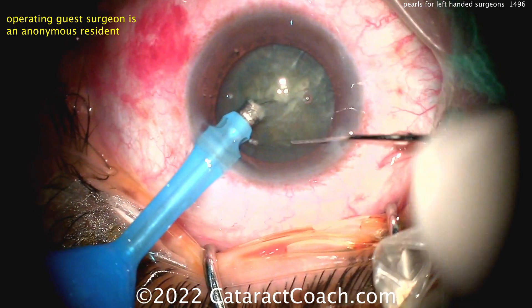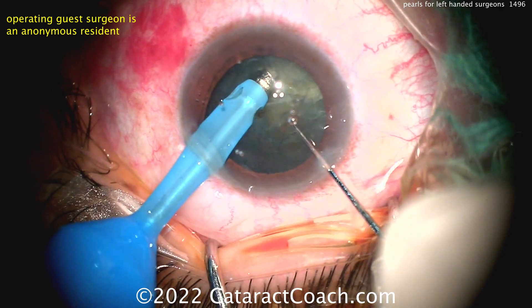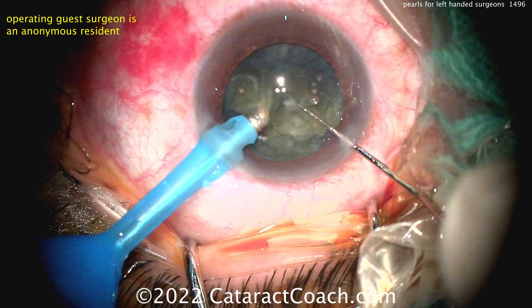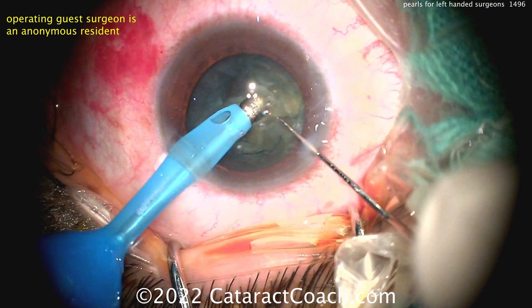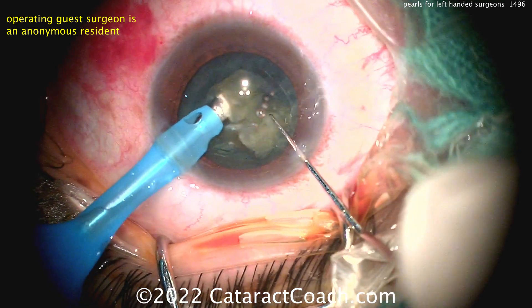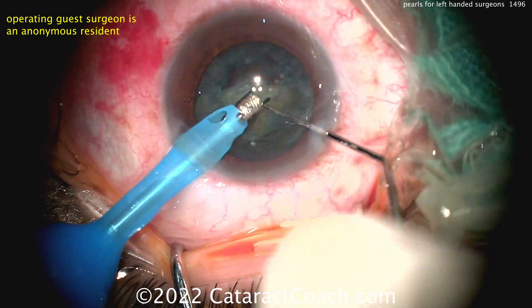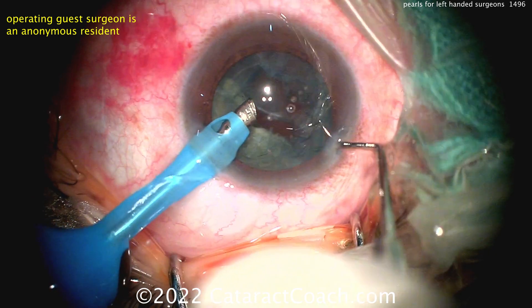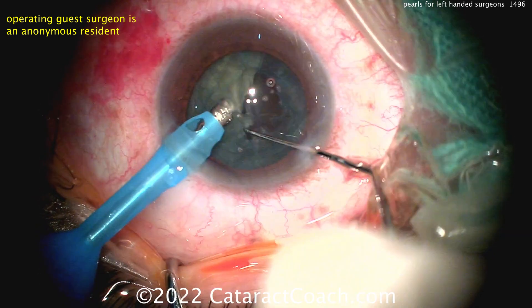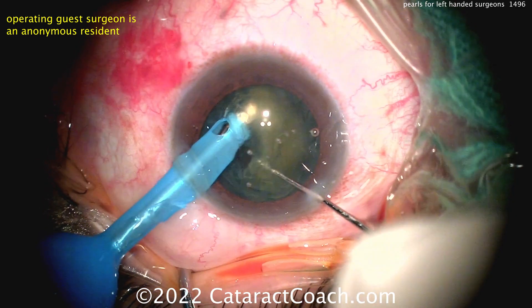Here, the surgeon has the FACO probe in the left hand and the chopper in the right. This works out very well, because most of the movement is being done by the chopper — the FACO probe is relatively still inside the eye. The chop technique and the main movement here is from the right hand. So this is a left-handed surgeon who has decided to hold the FACO probe in the left hand but use the chopper in the right.